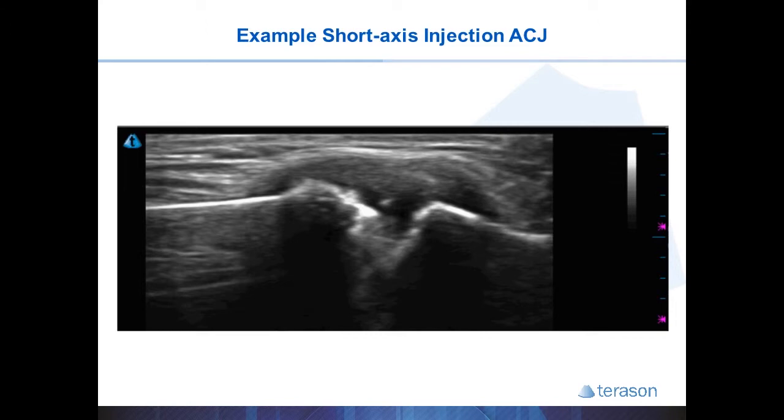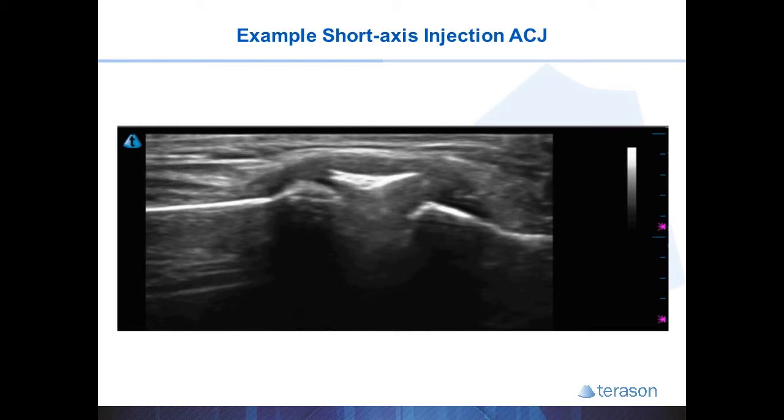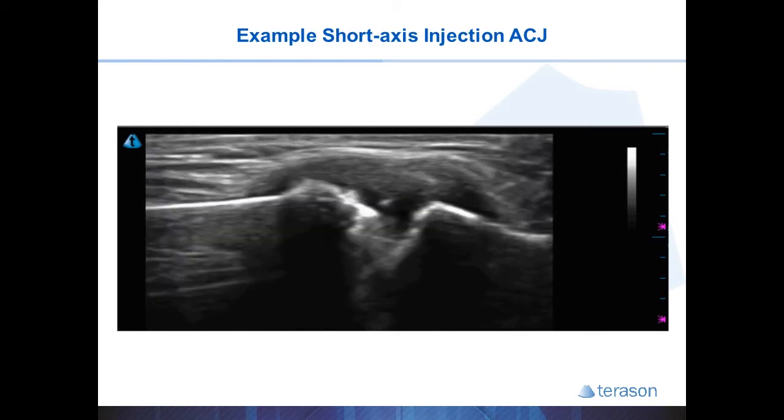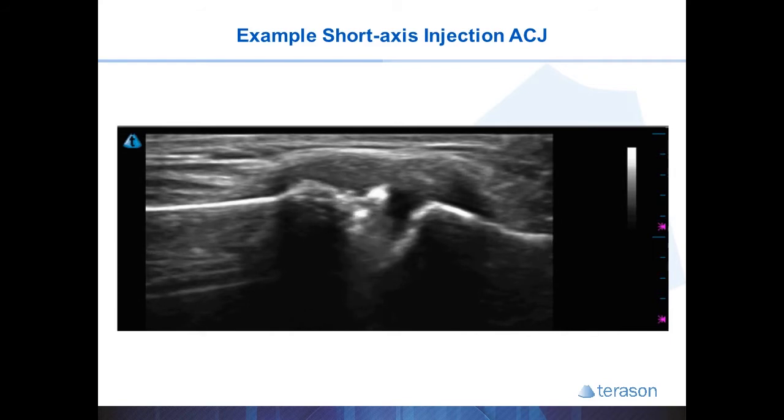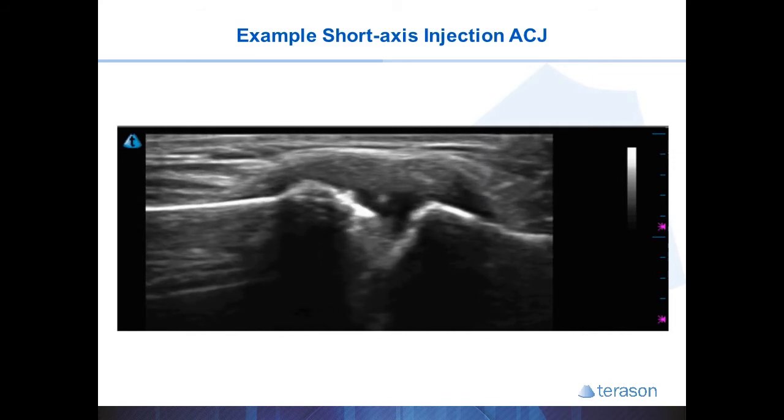You'll notice in this video that the cortisone and some micro air bubbles inside the fluid create a hyperechoic flash that helps confirm you're in the joint capsule and the injection of the cortisone filling the joint. You'll see a dot that disappears, reappears, and then injection. That is a great technique to make sure you're seeing the needle tip and not part of the shaft on the image.